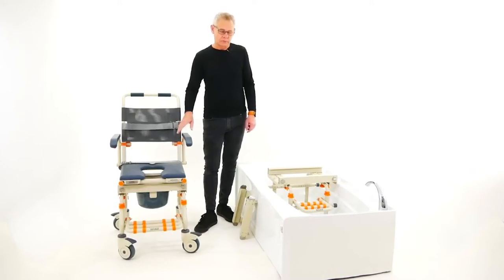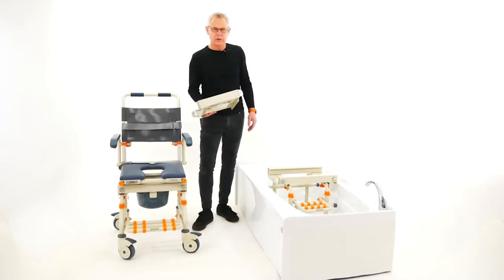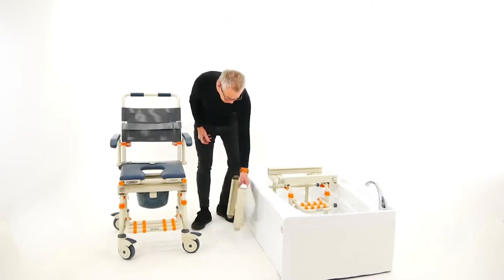The Tub Buddy SB2 model has been around for 10 years and it's a fantastic product. When you consider buying a Tub Buddy, you get the chair — the rolling base chair — you get a bridge, which is like your link to freedom and accessibility in the shower, and you get a bath base unit.